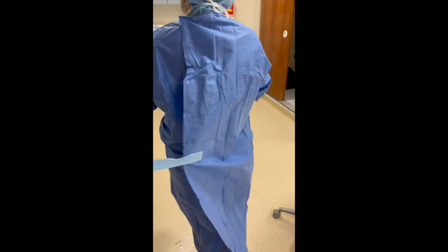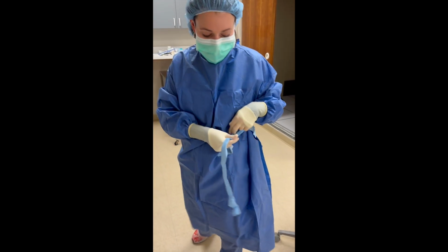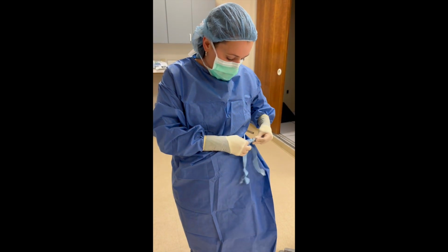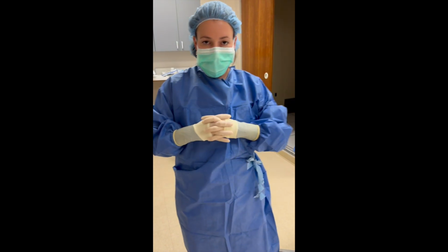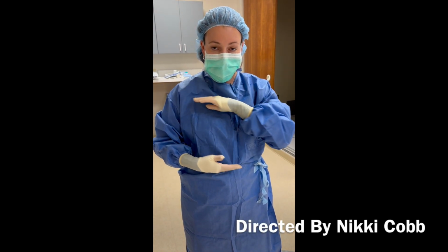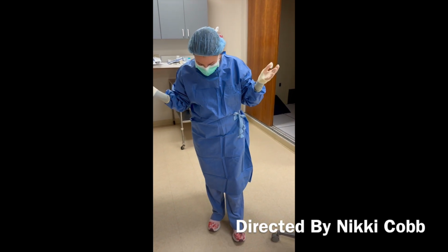I twirl, hold the tab, and I pull this off, and now the assistant could throw that tab away, and I'm tying my sterile knot. And from here on out, my hands are going to stay right here. Again, they have to stay above the waistline, below the collarbone, and this is your surgical area. And now I am ready for a sterile procedure, minus my shoe covers.